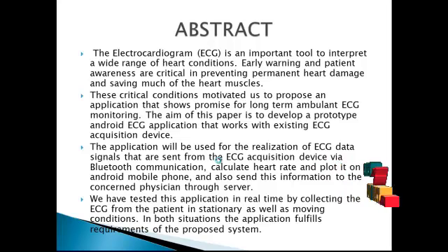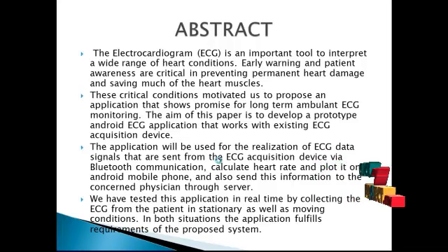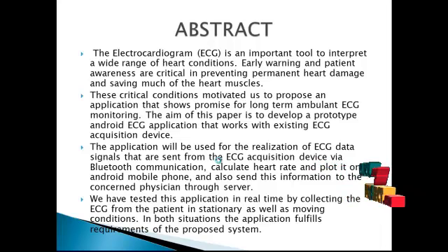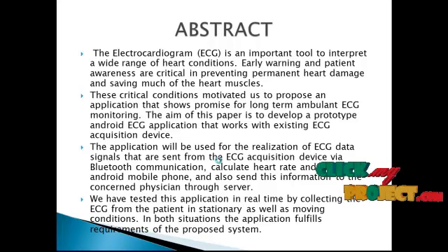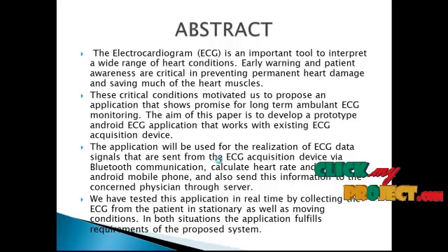The aim of this project is to develop a prototype Android ECG application that works with the existing ECG acquisition device. The application will be used for the reception of the ECG data signals that are sent from the ECG acquisition device via Bluetooth communication, calculate heart rate and plot it on an Android mobile phone, and also send this information to the concerned physician through a server.